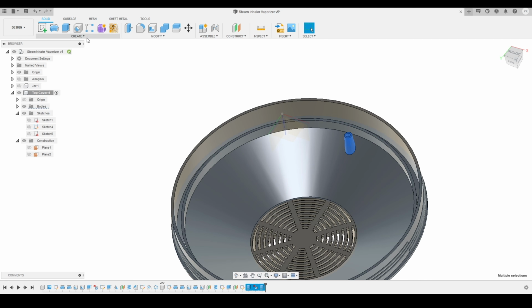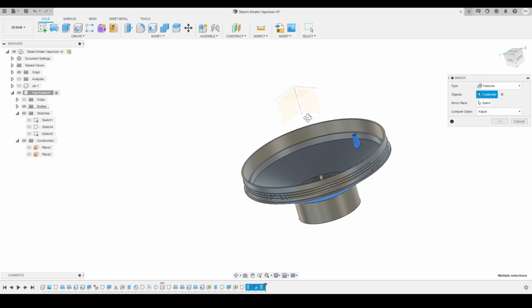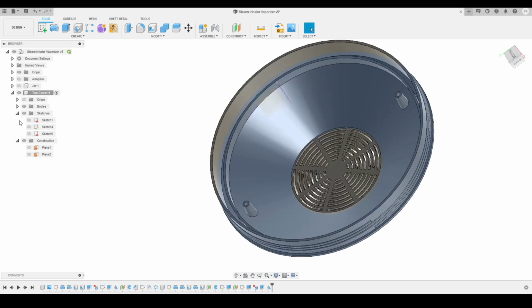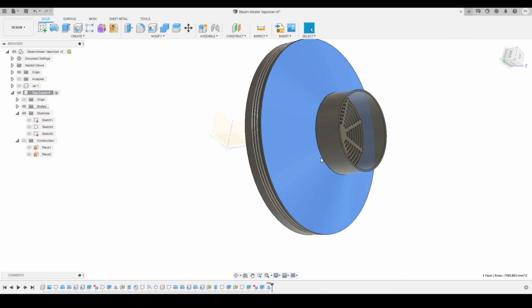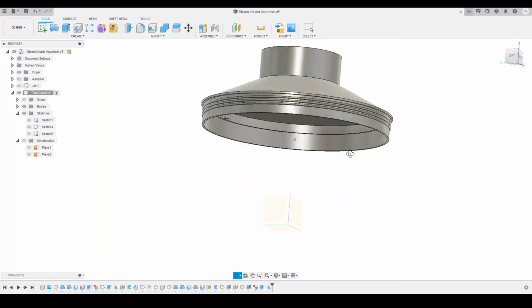So I will select all these features and activate the mirror tool, and now I'm going to select the mirror plane. We'll activate this option here, then select the mirror plane, and you can see it is getting mirrored on the other side as well. We needed that particular feature on both sides, that's why I mirrored it on the other side. And now I will turn off all the construction planes. So here you can see this is the result we got. Now we'll move on to our next feature.